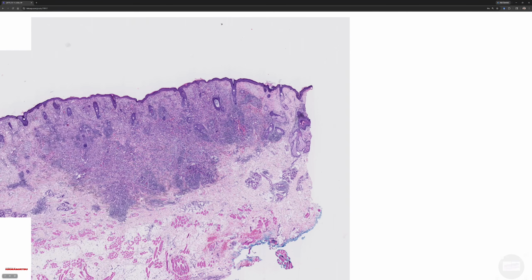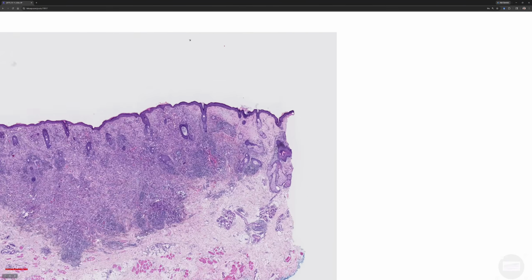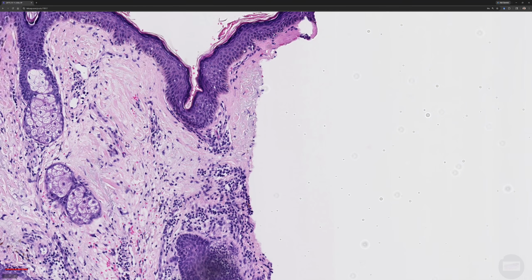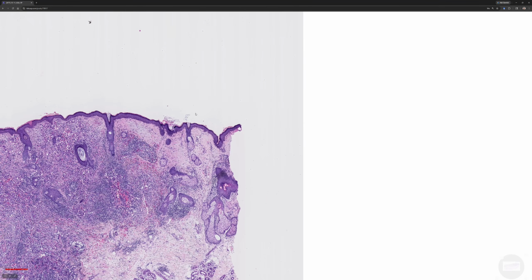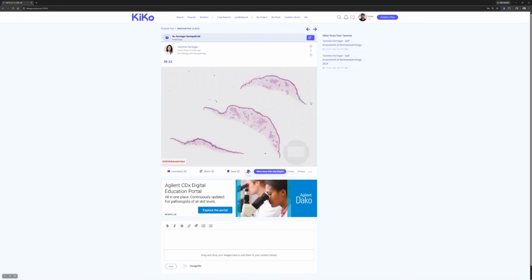Yeah, very scary. I've got tons of videos on angiosarc. This is a big excision, but you can see it still probably goes to the margin here. Probably sneaking out. I don't know if this is a real margin or not in this case, but angiosarcoma. And the ones in radiated sites or chronic lymphedema sites often have c-MYC amplification, as a little board pearl for study purposes.